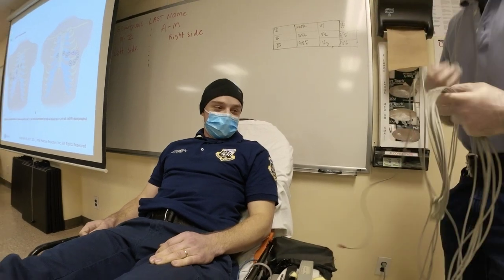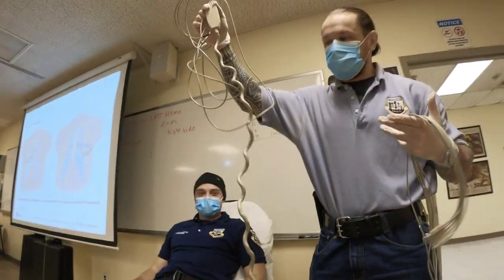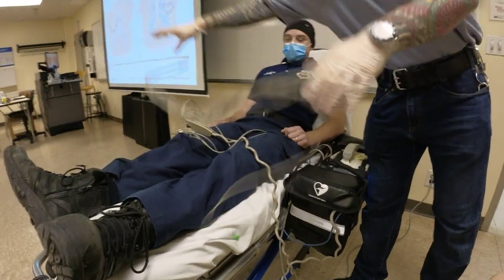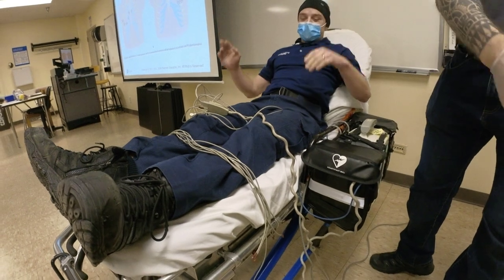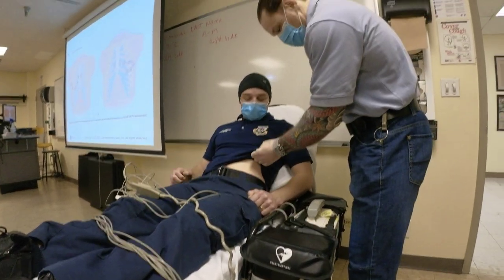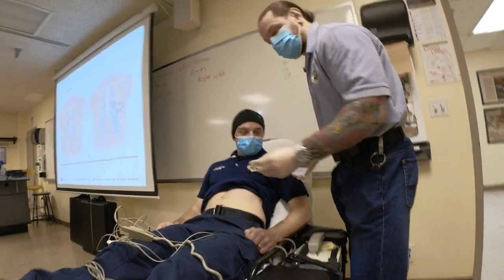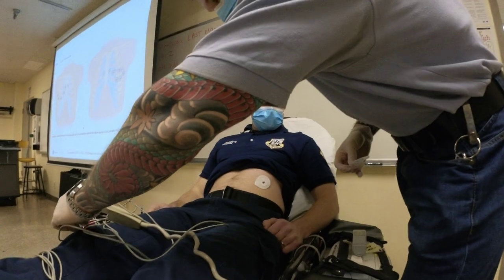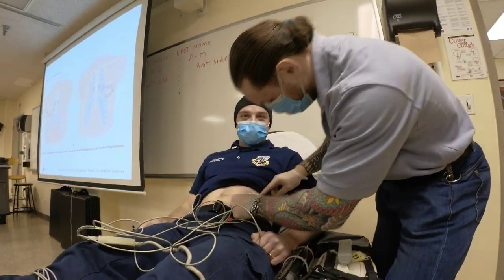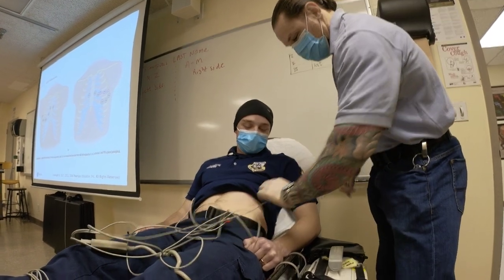All right, guys. So look. This is your limb leads. This is your precordial leads. One thing that you don't want to do is this. I'm just going to lift it up for a second. What you don't want to do when you're applying the leads is first apply the leads and then do this. It's painful for the patient, so please don't do that.